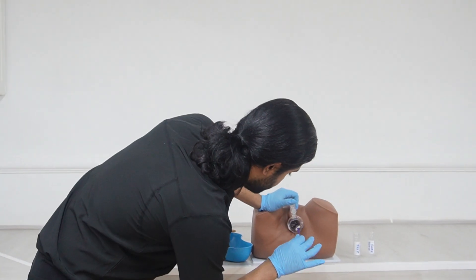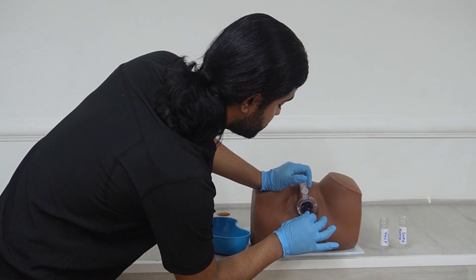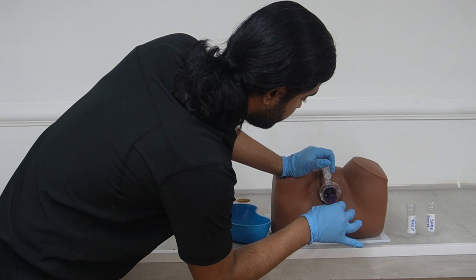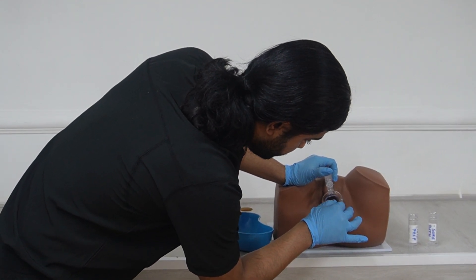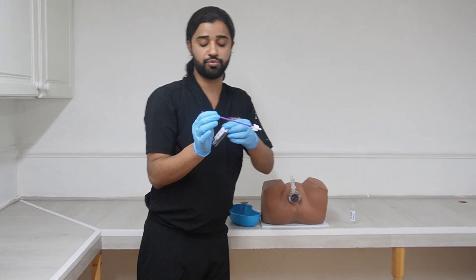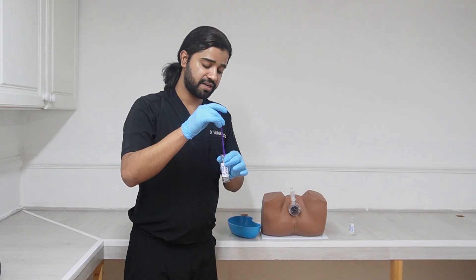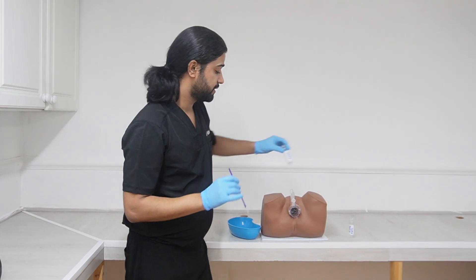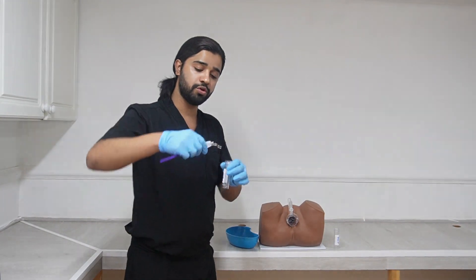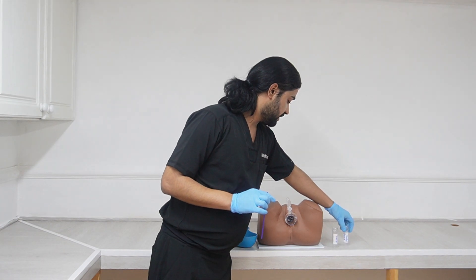Insert the brush and take the sample from the endocervical wall — insert and rotate it five times, 360 degrees: one, two, three, four, five. Make sure you do not touch the blades. Then take it out. If the solution available is ThinPrep, agitate the brush ten times in the solution: one through ten, then discard the brush. If the solution available is SurePath, simply detach the brush head and place it into the solution, then discard the handle.